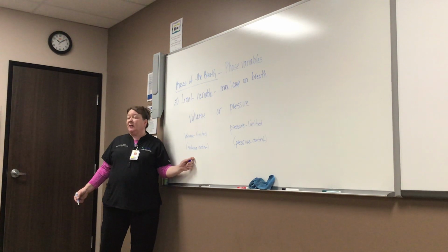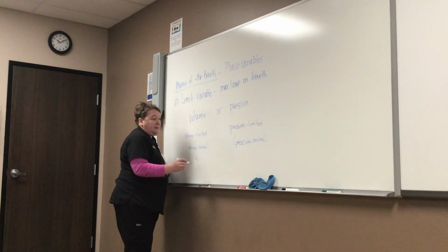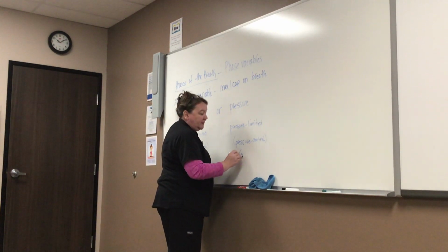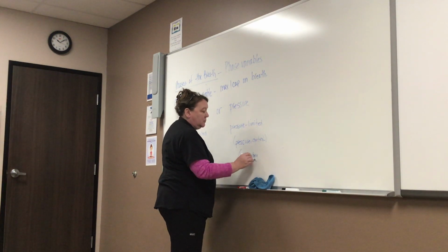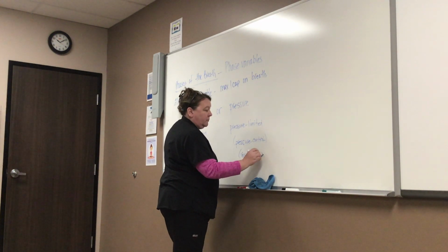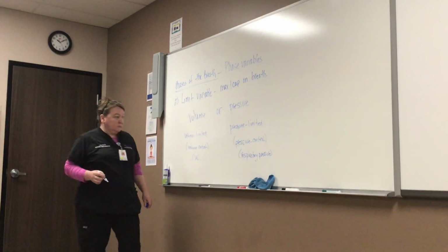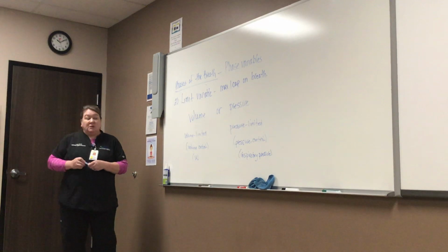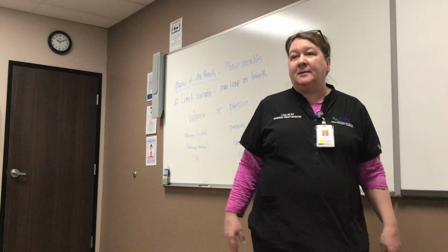So when you get to 500, don't go above 500, or whatever your tidal volume is set at. So this is gonna be my tidal volume. And this is gonna be my inspiratory pressure if I'm in pressure control. So in pressure control, we're gonna say don't go above 20, or whatever we decide to set it at.